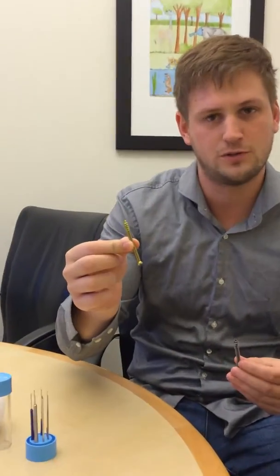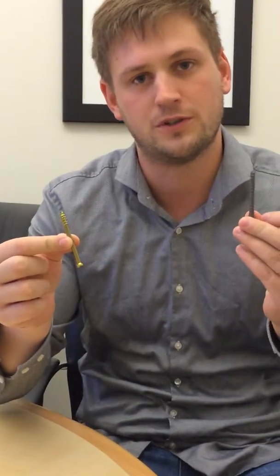Hey everyone, this is Mark Trena with the foot and ankle team. Today I'm going to show you our demo showing the difference in holding power between traditional lag screws and AccuTrack two screws.